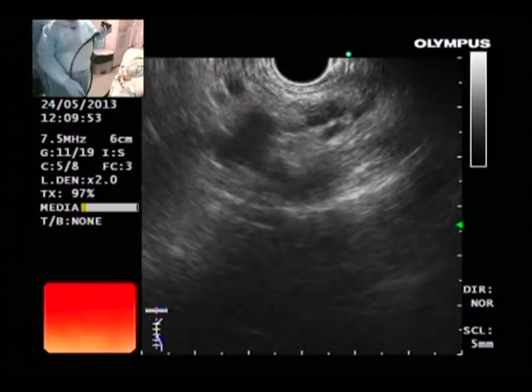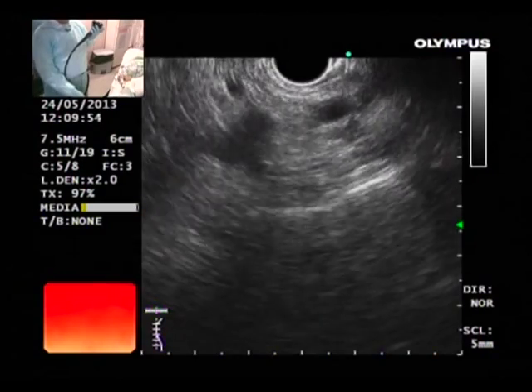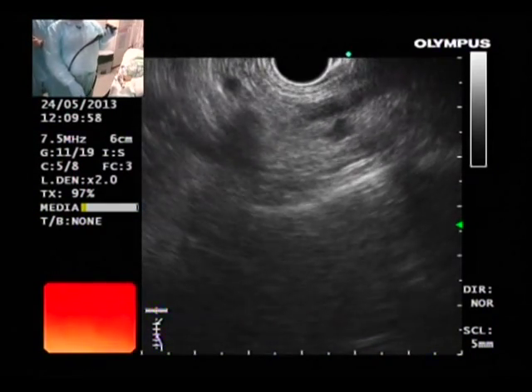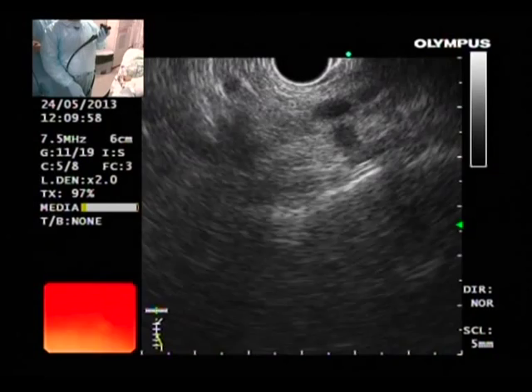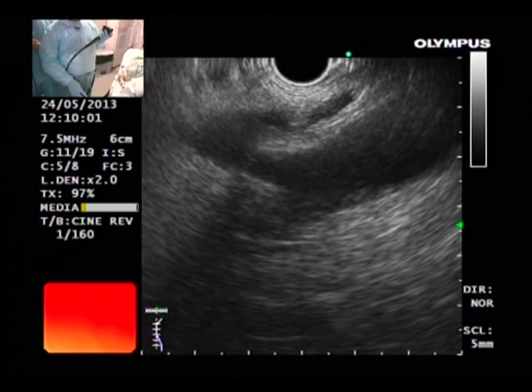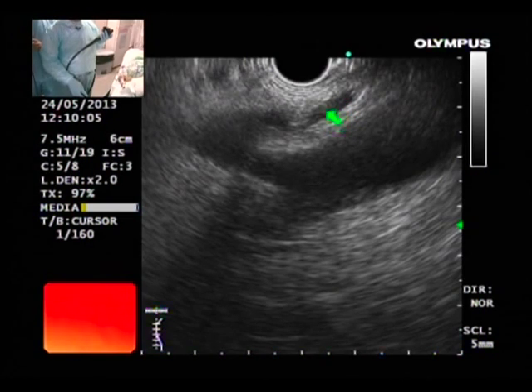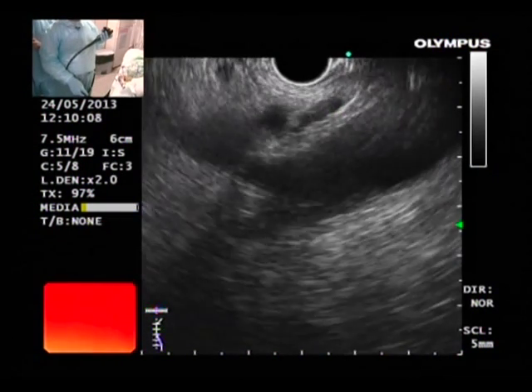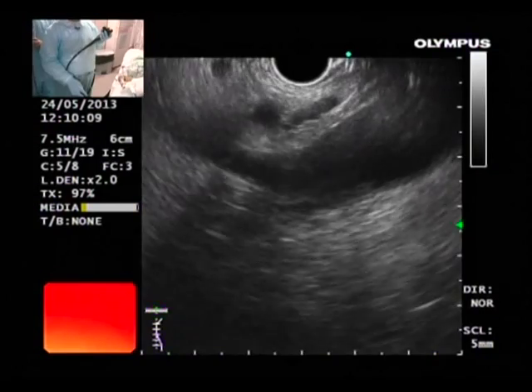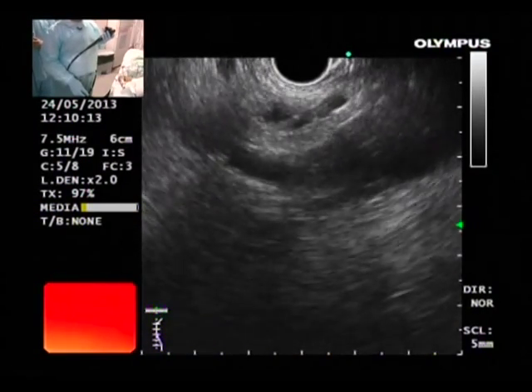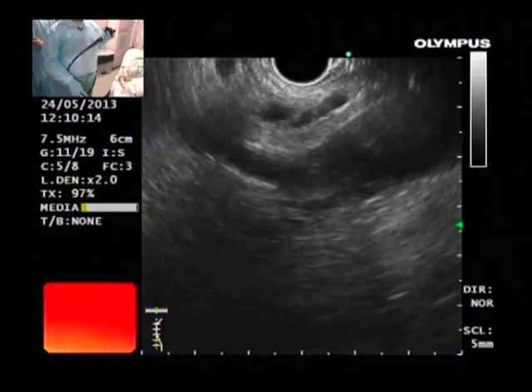I have made the picture bigger. You agree that this is the celiac axis? Ganglia should be visible here. That is the celiac ganglia — easily visualized. We are lucky here. See this? This is the ganglia. So this is the celiac axis and we are seeing the ganglia. Our job is easy now — we inject.